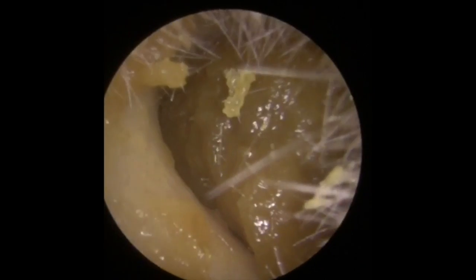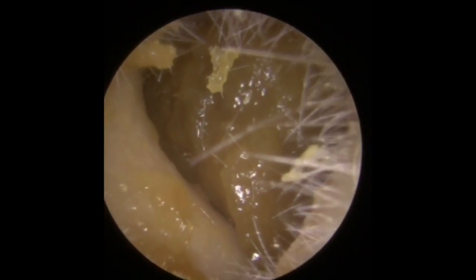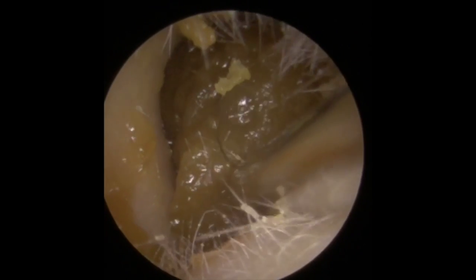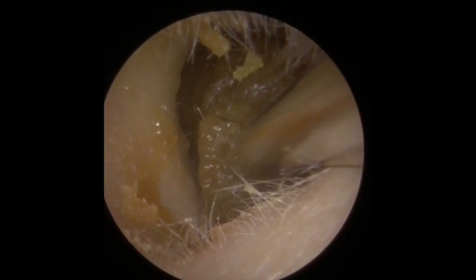Hi everybody, this is Rhys Barber from Audiology Associates. Thank you very much for watching our earwax removal compilation video today. We have three patients in this video who have come through clinic in the last few days. With this first patient, they have some very hard wax, certainly from the outer part of the ear canal.